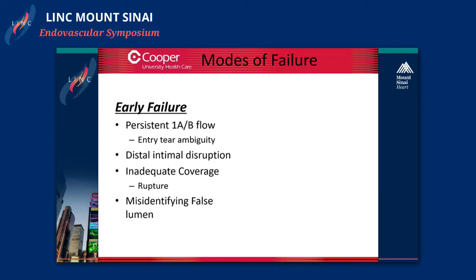And then you could also misidentify the false lumen, where the wire goes in and out of the true and the false lumen, which is an absolute nightmare. But I don't have a case to show you about that, thank God.